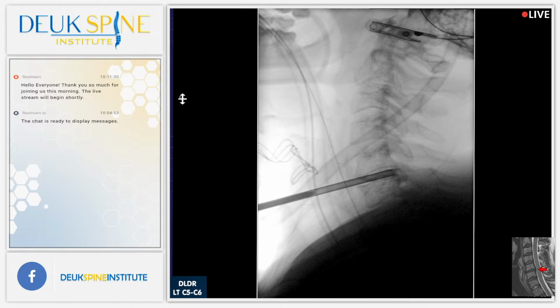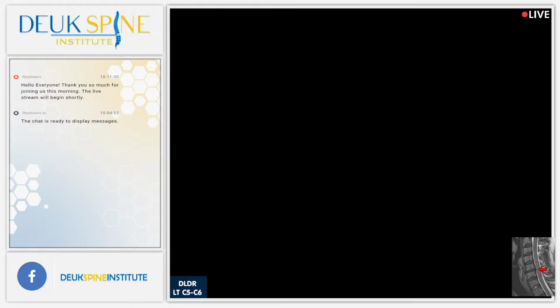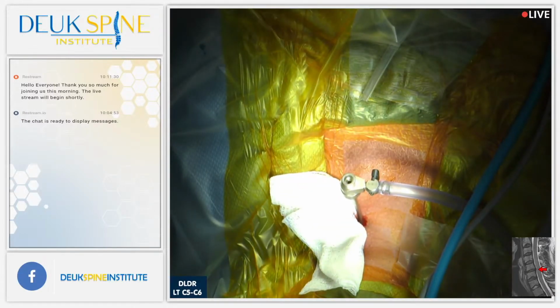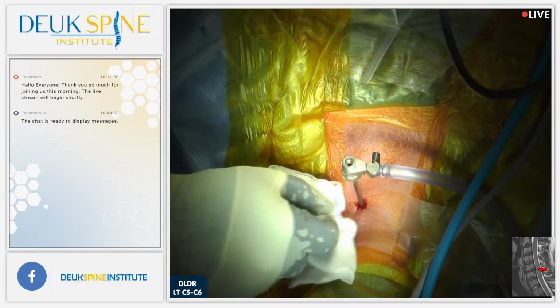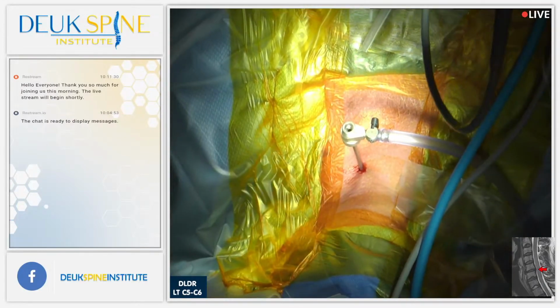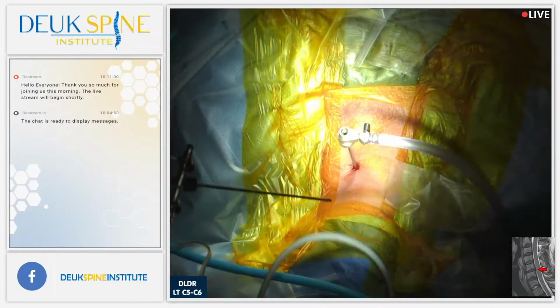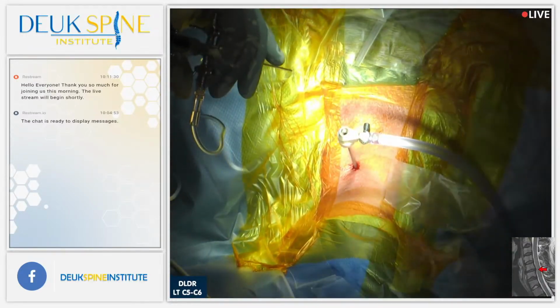All right, let's show the audience, Henry, just how the Deuk laser disc repair actually works. This is a procedure that was developed at Deuk Spine Institute. We've been doing it for 17 years here, and we've had 1,700 procedures performed.